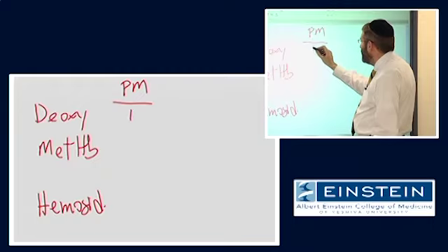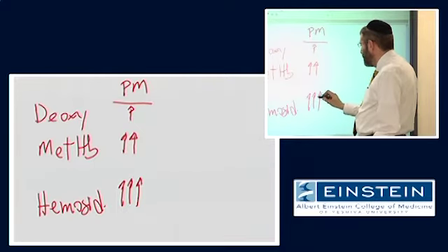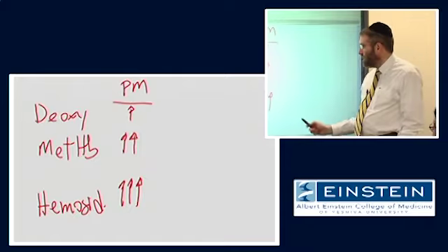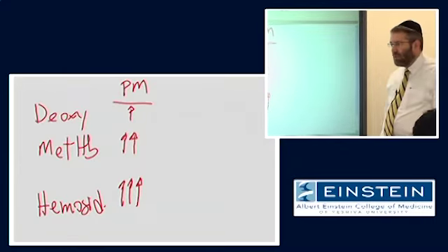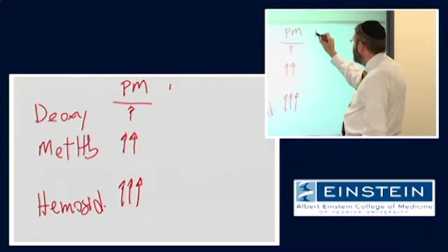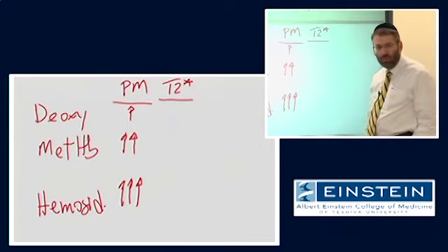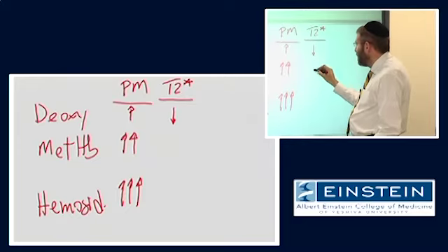Well, they are increasingly paramagnetic. Because they are increasingly paramagnetic, we would expect that they would all lead to, on a T2 star weighted image, what effect on our signal? There would be loss of signal.